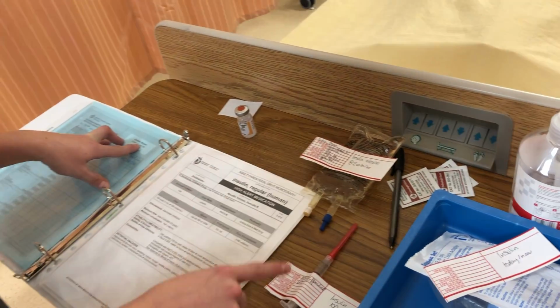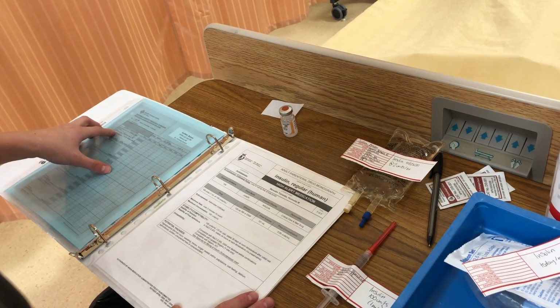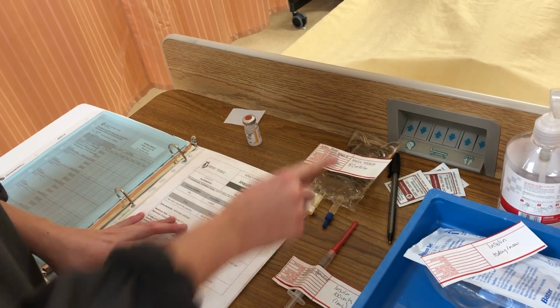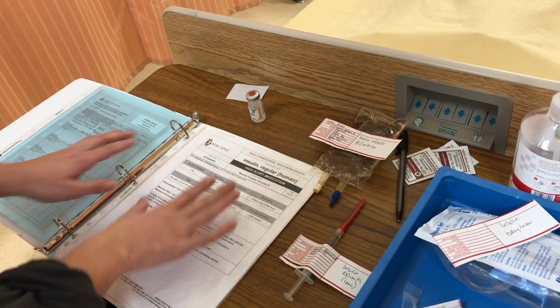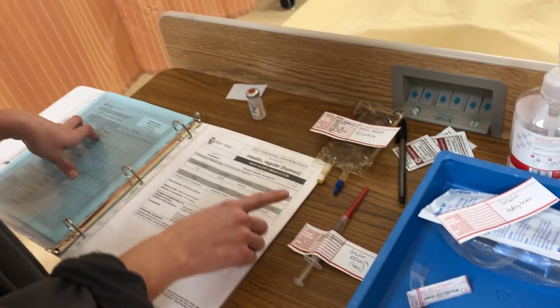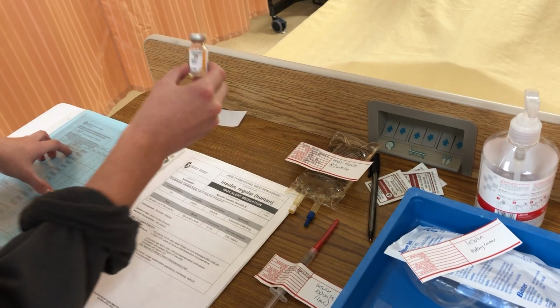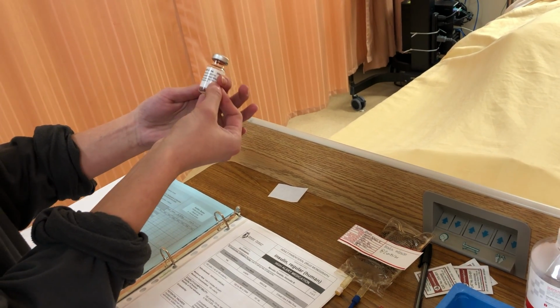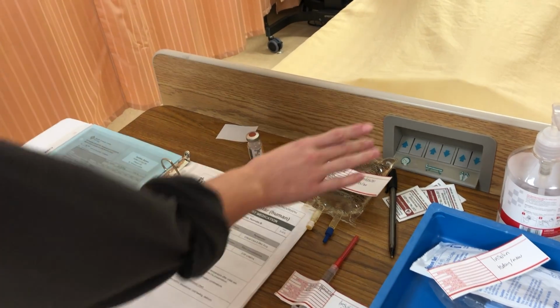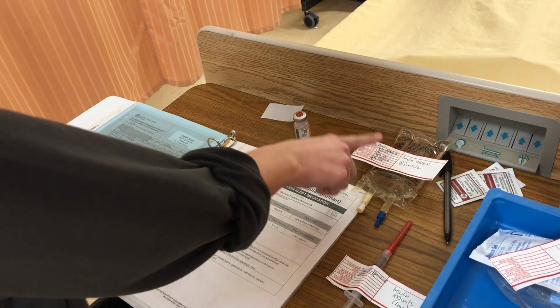We have Scotland Bryson, Scotland Bryson. We've gone over the FIN. So we have insulin Humulin R. I have insulin Humulin R, and we've gone over the PDM for insulin Humulin R. Our dose, so we drew up 100 units into this syringe out of our insulin that is 100 units per ml. So we've drawn up 100 units, which we followed this recipe on the PDM.